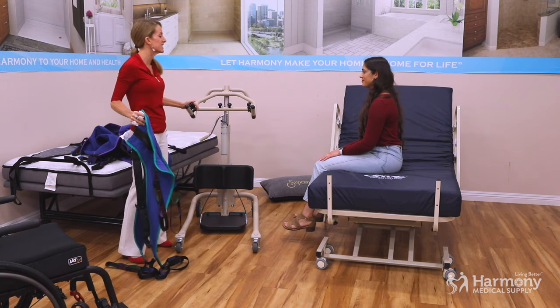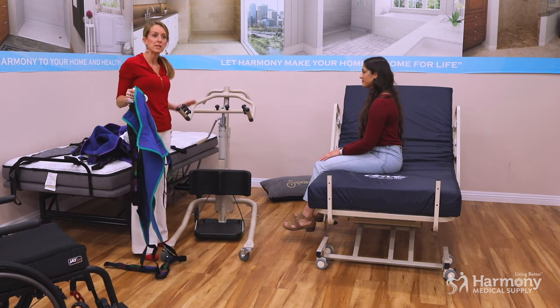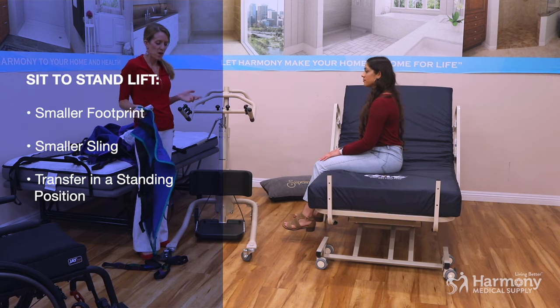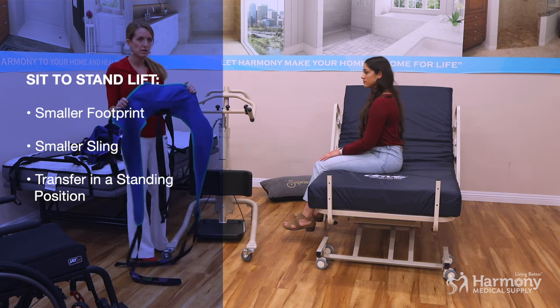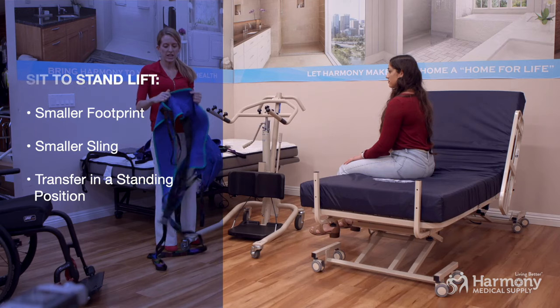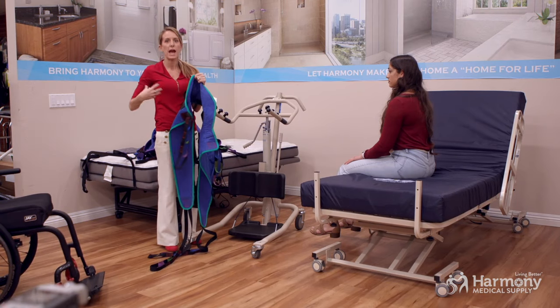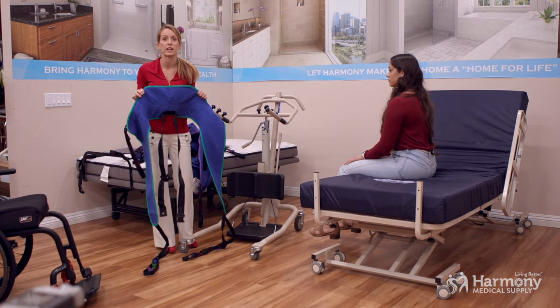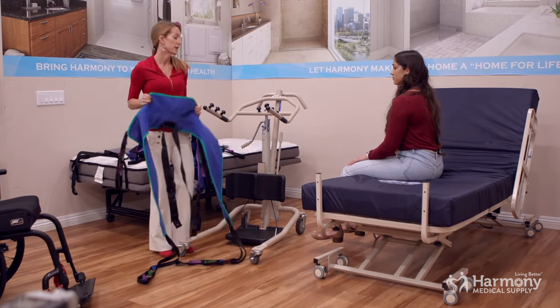Now we have a sit to stand lift, and this time it's a manual and hydraulic sit to stand lift. They also come in power. When you use a sit to stand lift, you have smaller slings. They do have options with more robust padding under the arms, but essentially it's a sling that goes behind your back and under your legs — looking like a U-sling.